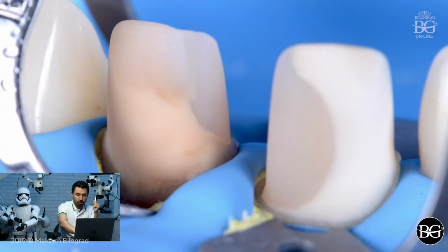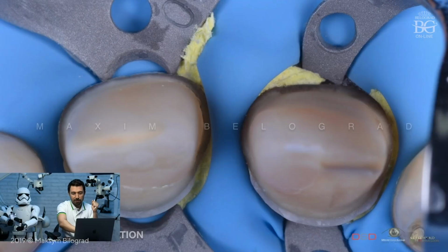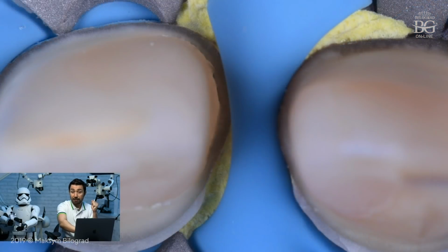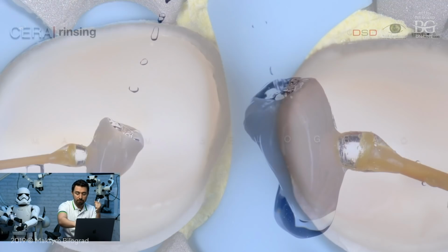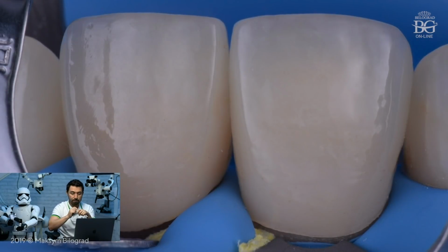So you can see some pictures that were taken with a DSLR camera with a twin flash, sandblasted teeth, proper adhesive protocol. We can bond to enamel, we can bond to dentin, we can bond to composite utilizing the proper bonding protocol. And what is super important also is to check dry fit.